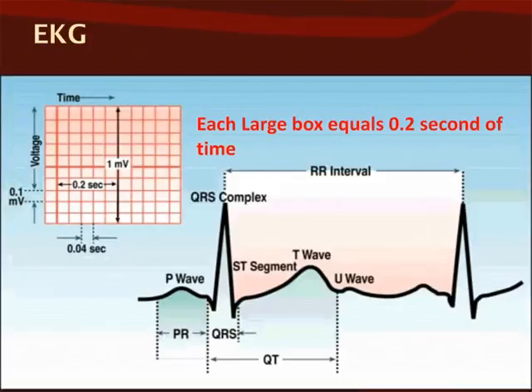The ECG is a graphic representation of the electrical activity in the heart. So by counting the boxes, we can establish the time the complex takes to travel. By counting the number in 1 minute, we then can establish the rate.